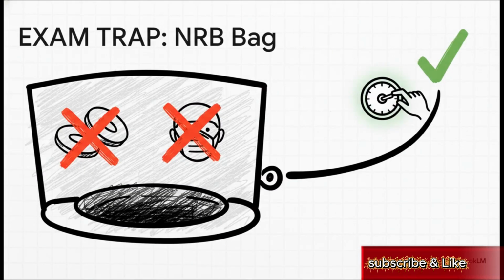Okay, listen up, because this right here is a classic NCLEX trap. I promise you'll see it. They'll give you a scenario, a patient with an NRB mask, and that bag is deflating with every breath. Then they'll give you a bunch of options like tighten the mask or open the flutter valves. Do not even think about it. Those are just distractors. They're there to trick you. The first, best, and only correct answer is to crank up that oxygen flow. Don't let them fool you.